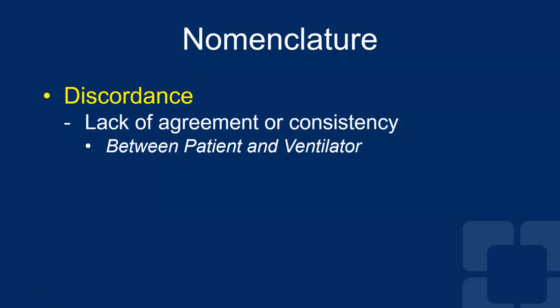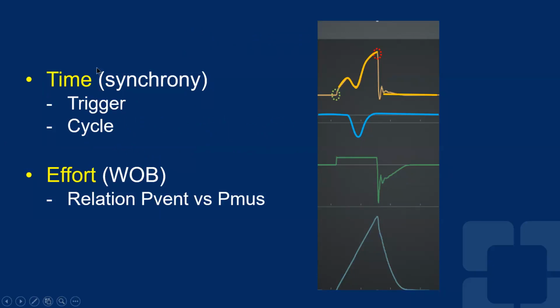So what we're going to do today is present the question that was placed on the survey. We're going to review the waveform, and then we'll use some examples to clarify some of the concepts as you're reading them. I do have to highlight, if you have not realized it already, how important Rob Chadbourne has been in describing and organizing all these concepts for all of us. Without him being my mentor, this would not have happened. So I know Rob is listening, and I appreciate everything that he has done.